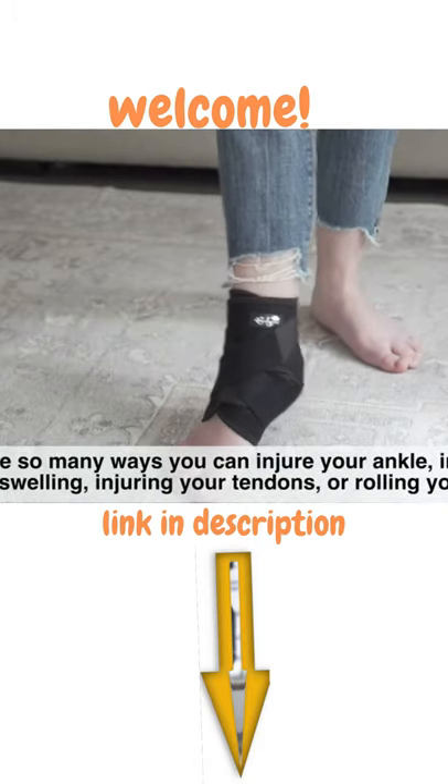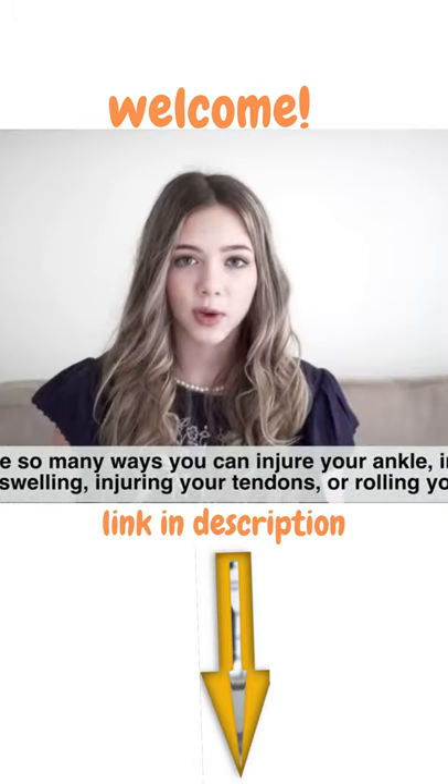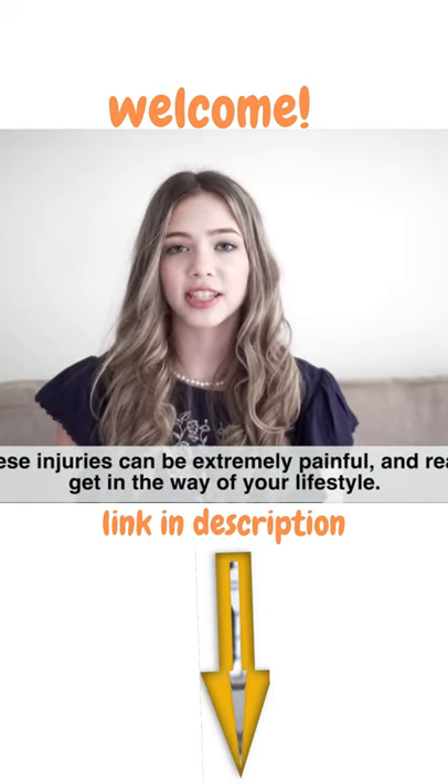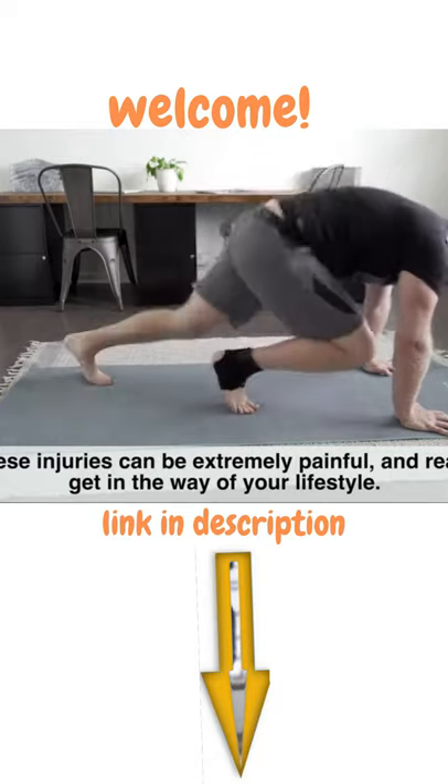There are so many ways that you can injure your ankle, including sprains, swelling, injuring your tendons, or rolling your ankle. These injuries can be extremely painful and really get in the way of your lifestyle.